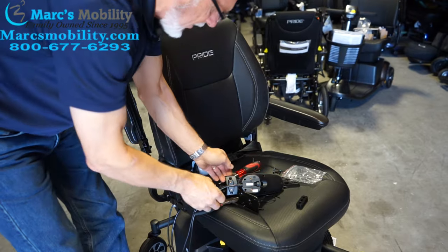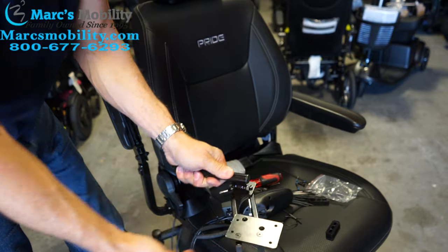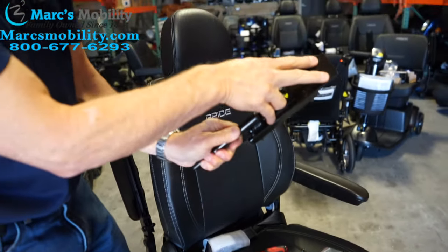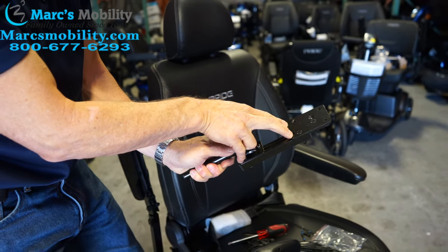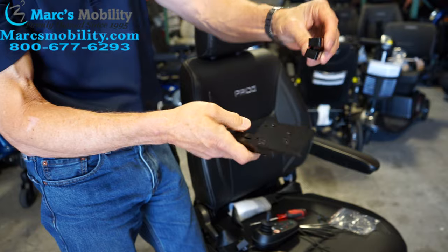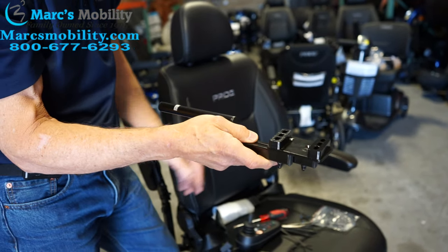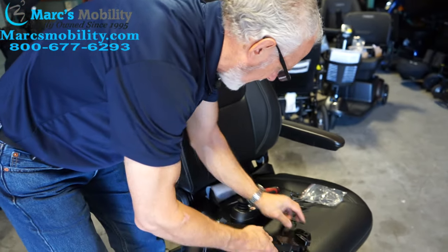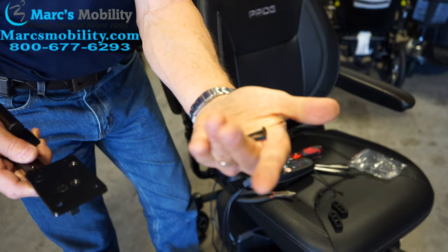Take your other bracket — the swing-away bracket right here. It swings out to the right, so it has to be positioned so it swings out to the right. You have two screws for the front for the joystick and two screws for the light switch. You also have two little risers, and you need to put those risers on before you put the joystick and light switch on. These come with four Allen wrench screws.